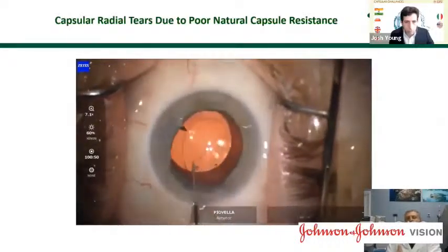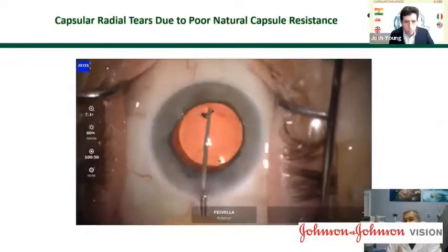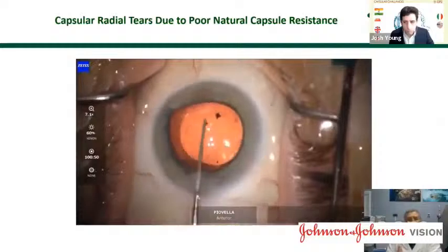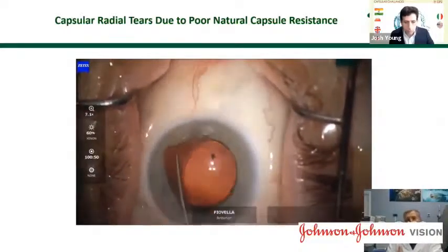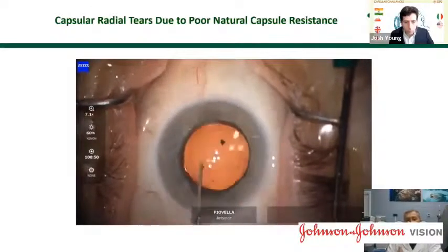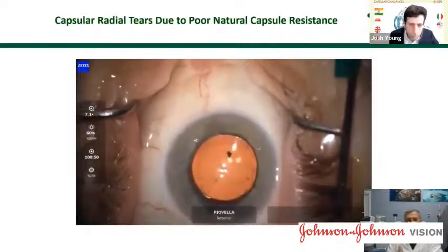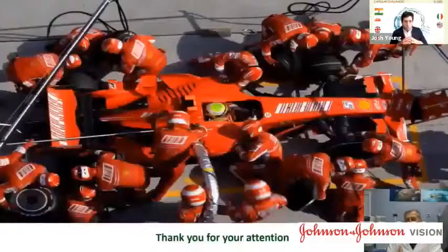What I mean is that mechanical capsulotomy could be performed effectively and cheaply, and I like it because I can apply it in intumescent cataract. And one more time, we need to provide a certain skill to manage this particular situation. And thank you very much.